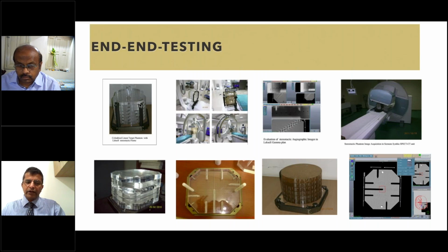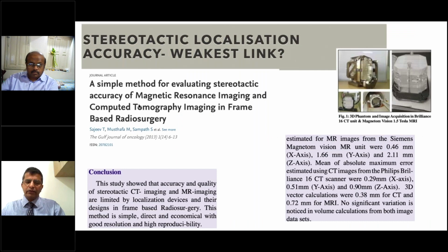And this phantom I use for assuring the quality of the MR, the QA of the MR linearity and geometrical accuracy. So this is one of the publications, and some of my experiences we published in the Gulf Journal of Oncology in 2013.